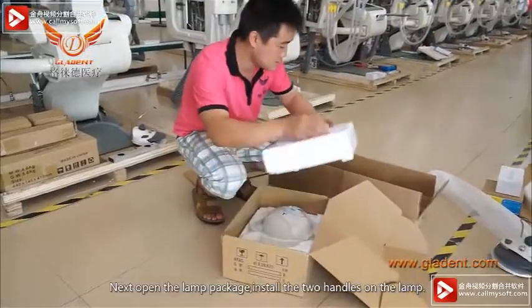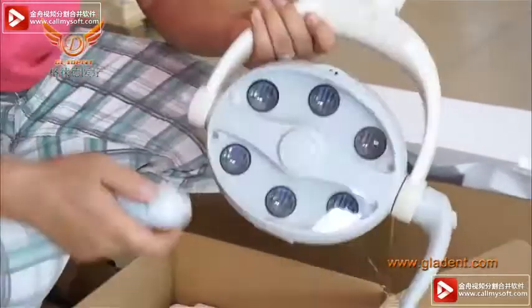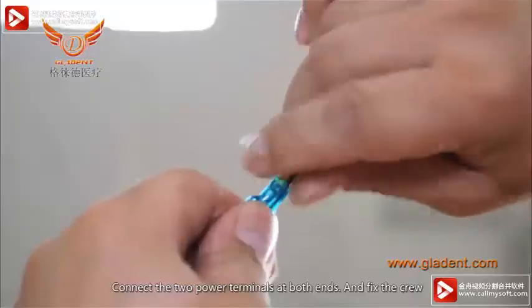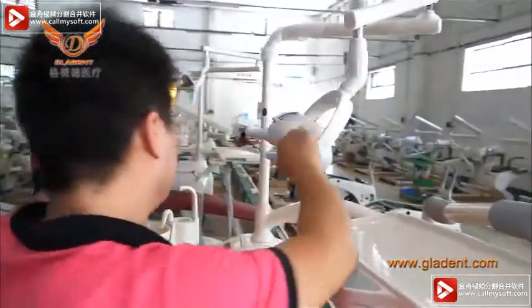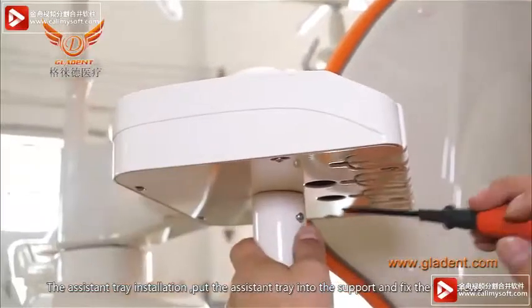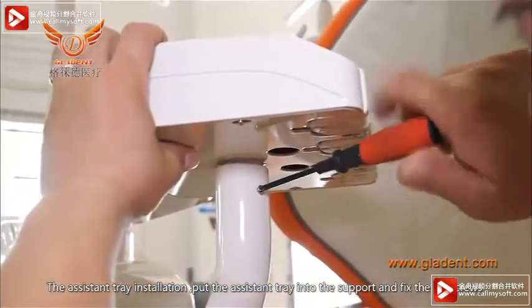Next, open the lamp package. Install the two handles on the lamp and connect the two power terminals at both ends. Fix the screw. Then install the assistant tray by placing it into the support and fixing the two screws.